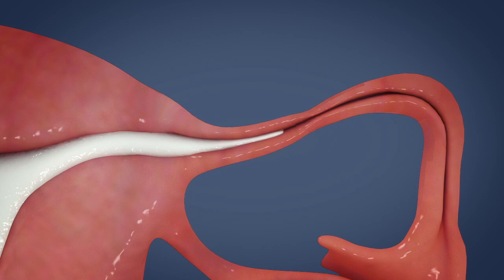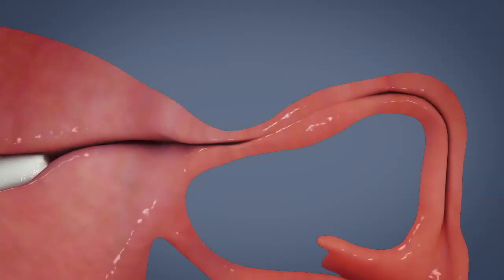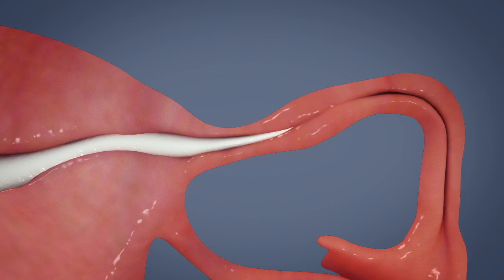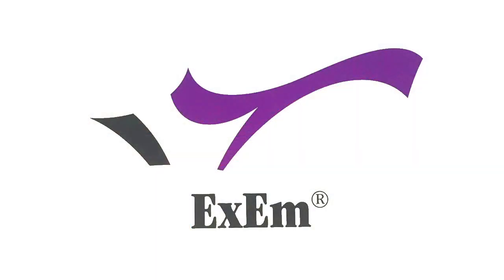In a healthy fallopian tube, the gel foam will run through the tubes and the fallopian tubes will be visible during the ultrasound procedure. If the fluid does not run through the fallopian tubes and the ultrasound procedure does not show the fallopian tubes, the passage in one or both of the fallopian tubes might be disturbed. This might indicate fallopian tube blockage. In this way, the XM Foam Kit enables safe and easy tubal patency testing.